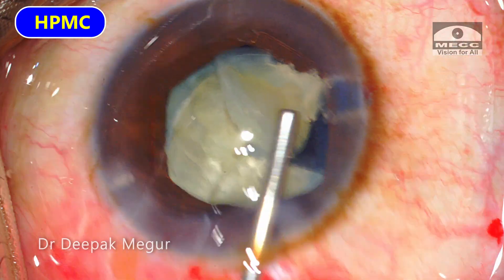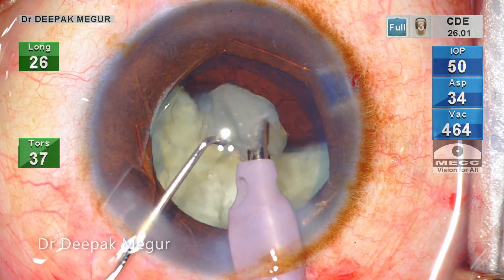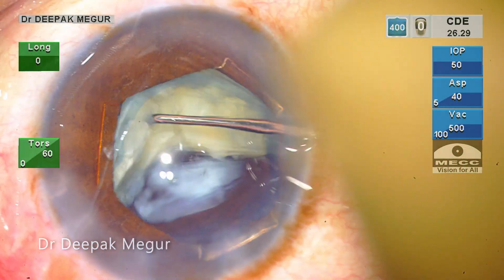It is critical to maintain the chamber at every step of the surgery. This will minimize the chance of the anterior capsular tear extending beyond the equator. Back to phaco — the fragment in question is emulsified eventually. The remaining hemi-nucleus is then divided into smaller fragments which are then emulsified.